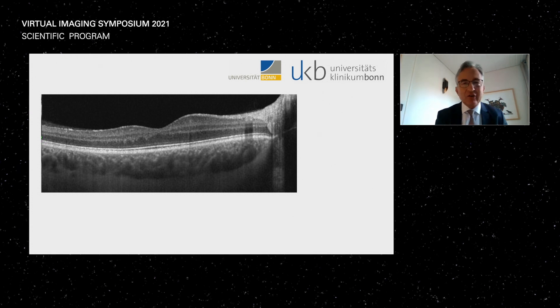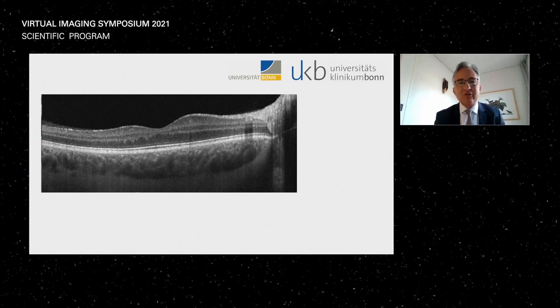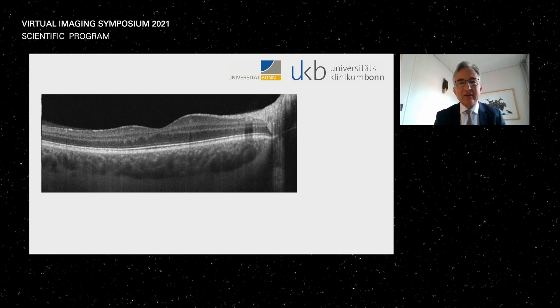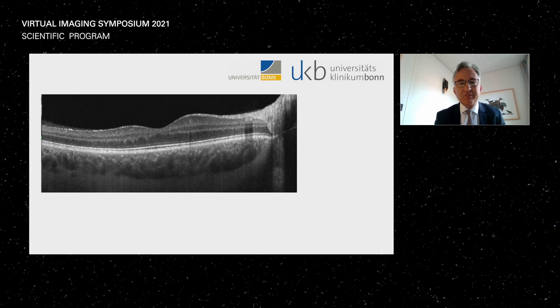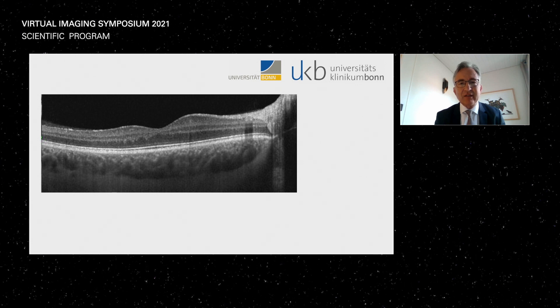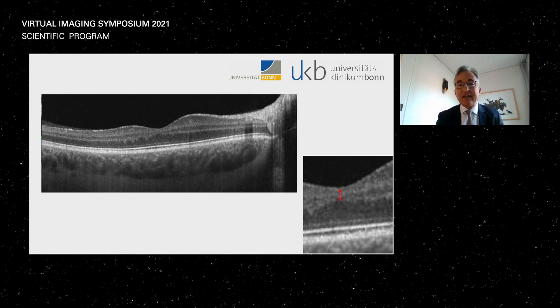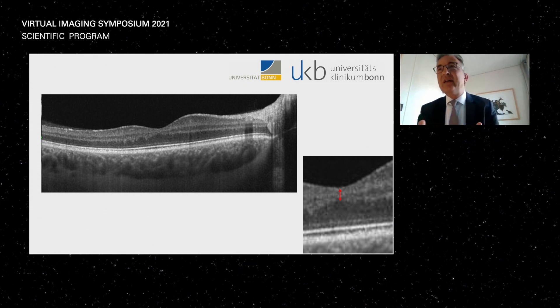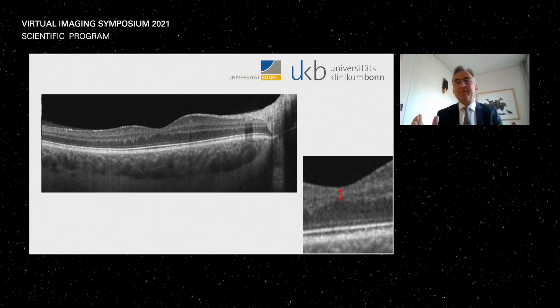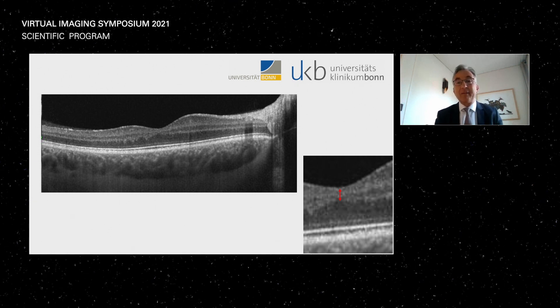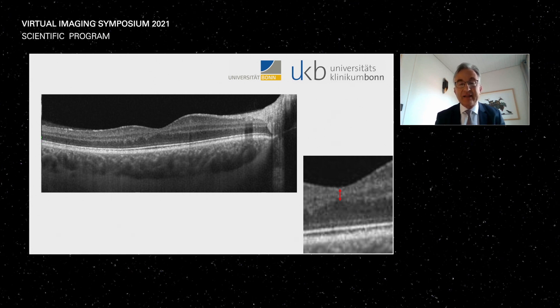There is a little bit of a hint of temporal thinning on the retina temporal to the foveola, which is not normal as we image with the Spectralis. We also see that usually we have centrifugal displacement of the inner nuclear layer and the inner plexiform layer, but here in the fovea there is inner retinal tissue which, as a matter of fact, shouldn't be there at this site.